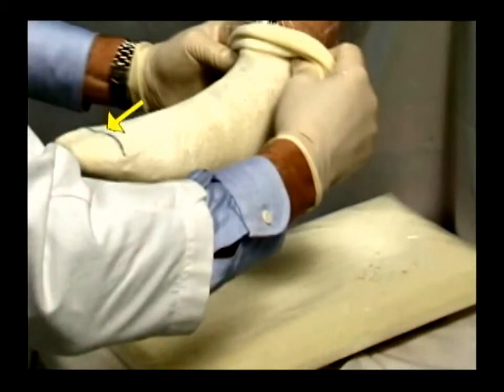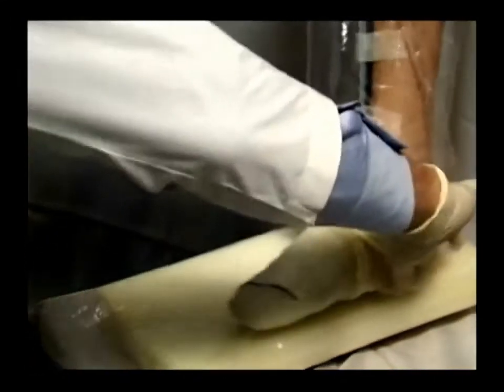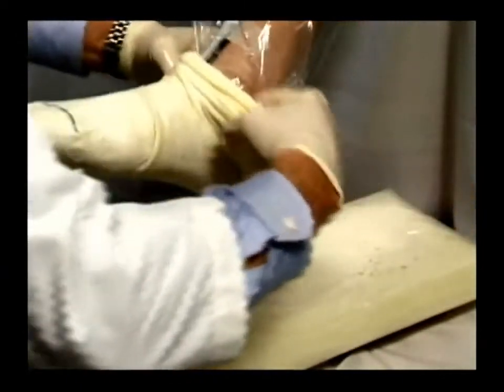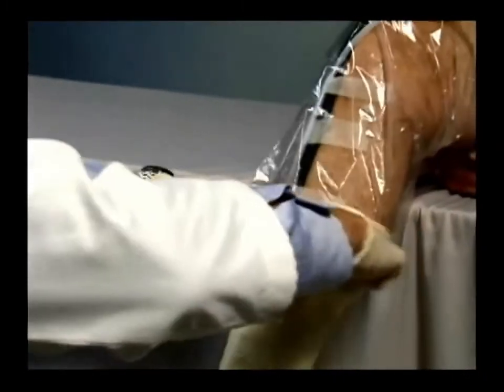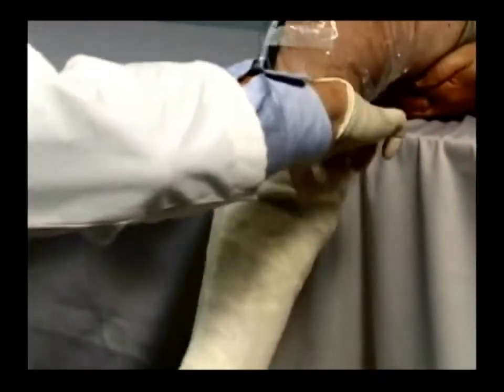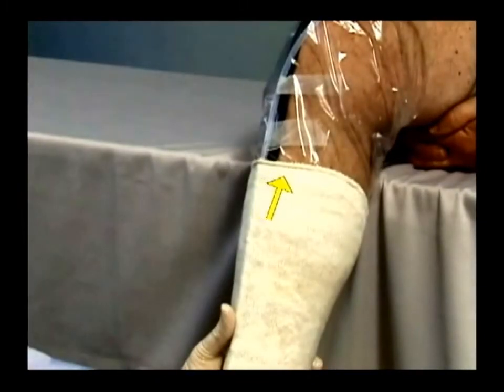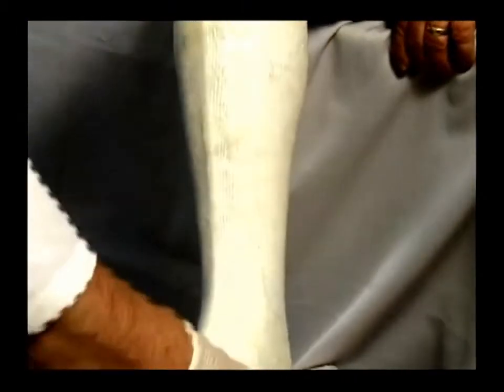The colored stitch line should be centered on top of all the toes and span evenly across the toes from medially to laterally. This will also assure the heel pocket is properly oriented. After correctly positioning the gathered sock, continue gently and carefully pulling the sock over the foot, around the heel and up the leg. It is important that as you pull the sock proximally, you gently stretch out all wrinkles as the sock leaves your fingertips. It will be difficult, if not impossible, to stretch out wrinkles after the sock is completely in place. Do not use too much force in pulling the sock as this may contract the toes and deform the foot. Make sure the entire length of the sock is stretched out with no overlapping of material at the proximal open end. The sock should be of uniform thickness along its entire length.